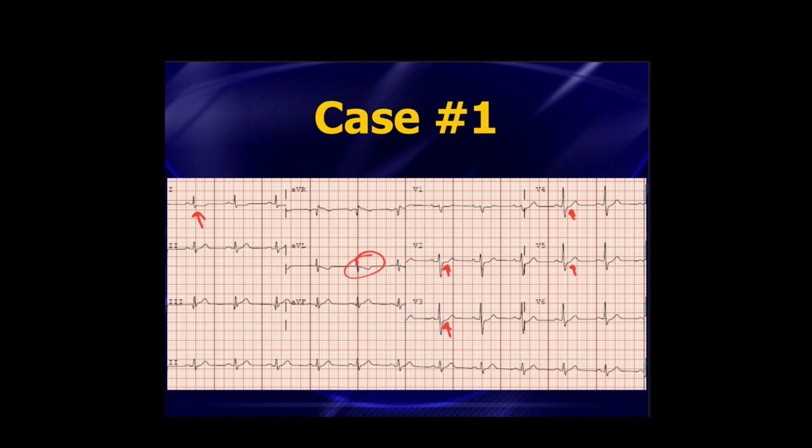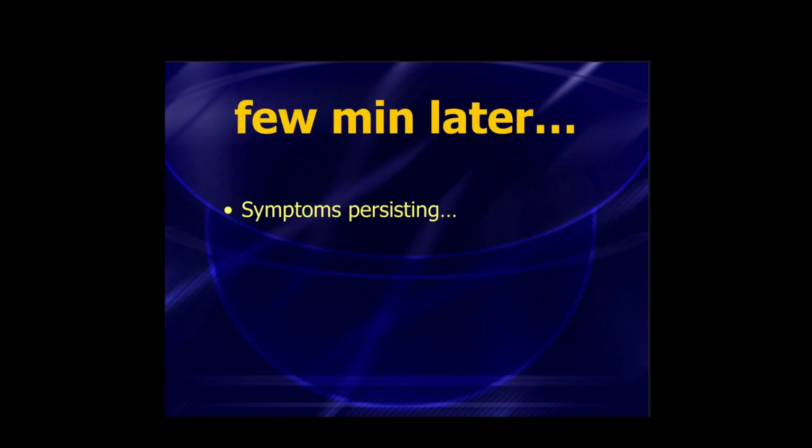We've talked about it many, many times before. This is your key feature: ST segment downsloping or ST segment depression or flipped T wave in AVL is predictive of an impending inferior wall STEMI, and Robert was all over this case right from the start.